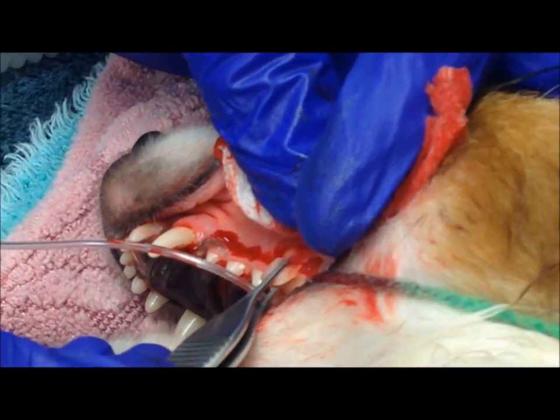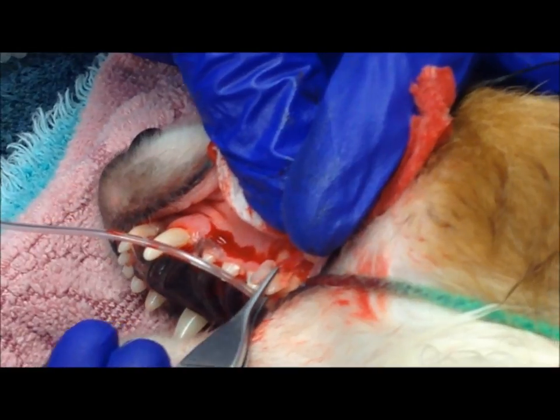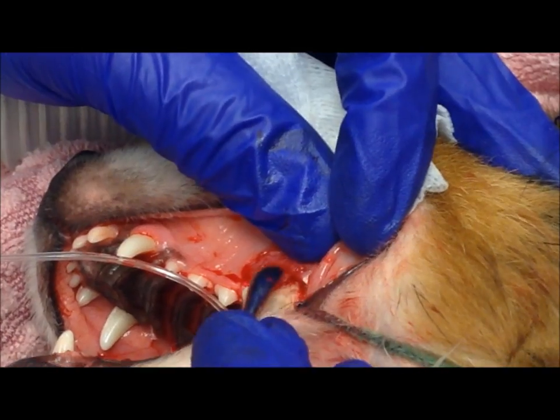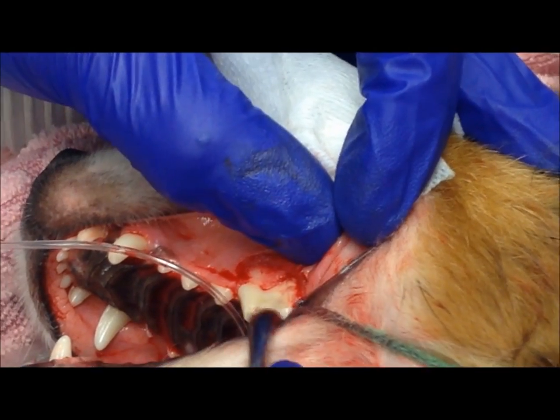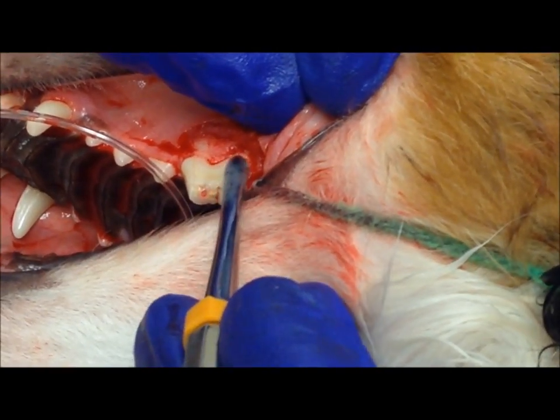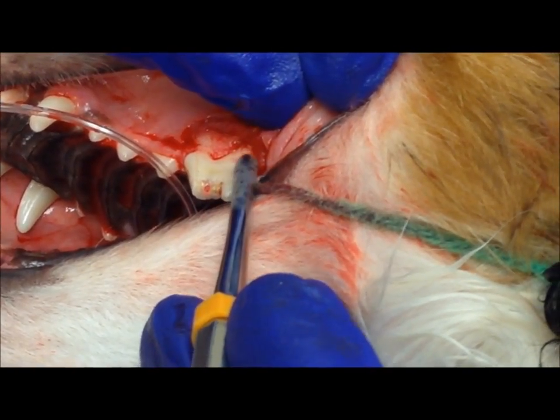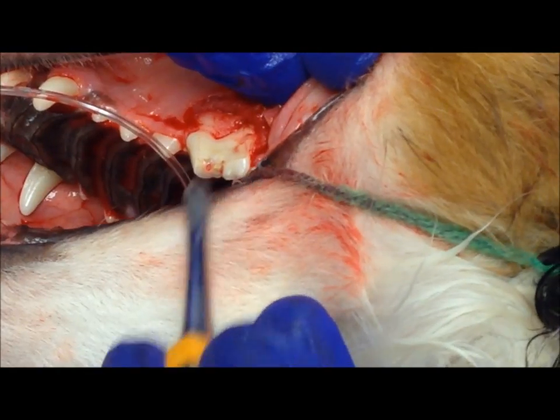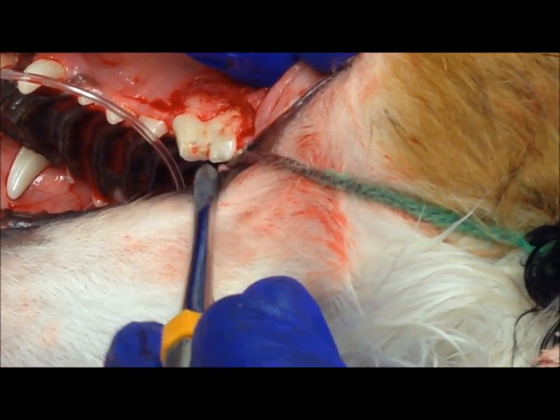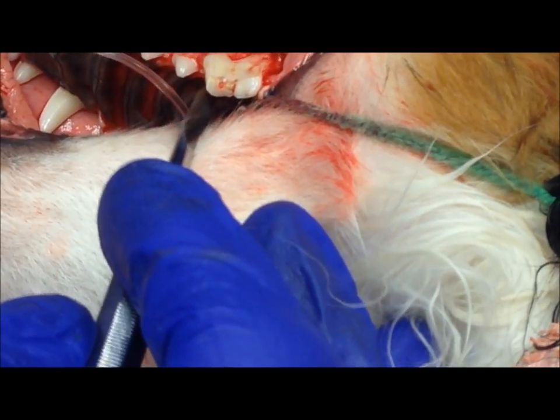The slab fracture fragment is really just attached by soft tissue and can be easily removed. With the gingival flap elevated, you can easily see that the slab fracture broke down all the way along this root, and you can see another remnant of the root canal right here. The next step is going to be to section this tooth into three pieces. I'll make a cut from here to here, and then a cut down here on the palatal side.